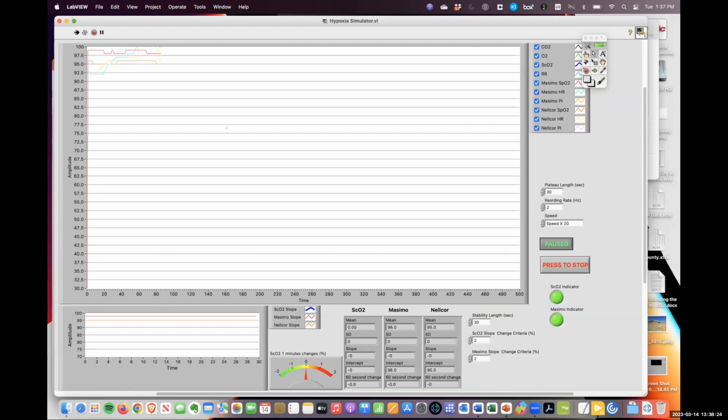We use a calculated saturation, which was based on Severinghaus's formulas. This is not what goes into the final statistics, but allows us to control the levels and particularly distribute the data throughout the saturation range. We do have fudge factors that can go into it that improve it so that it's almost perfect, and it can sometimes match the blood gas data better than the pulse oximeters do. It is also necessary because of the time delay that gives us breath-by-breath control, so we really know exactly where we are. We do use CO2.